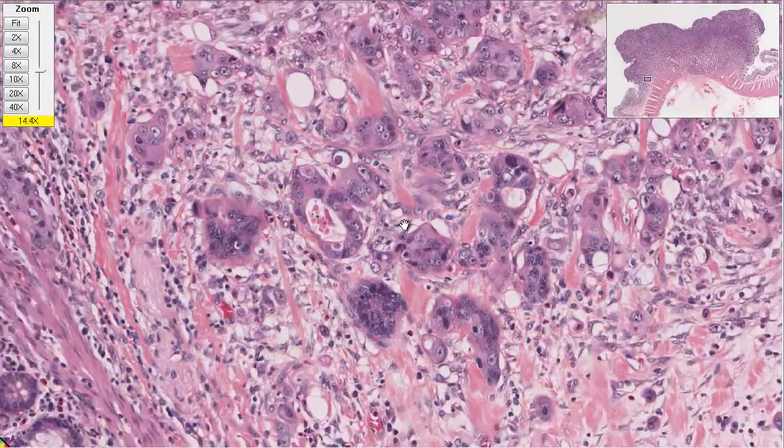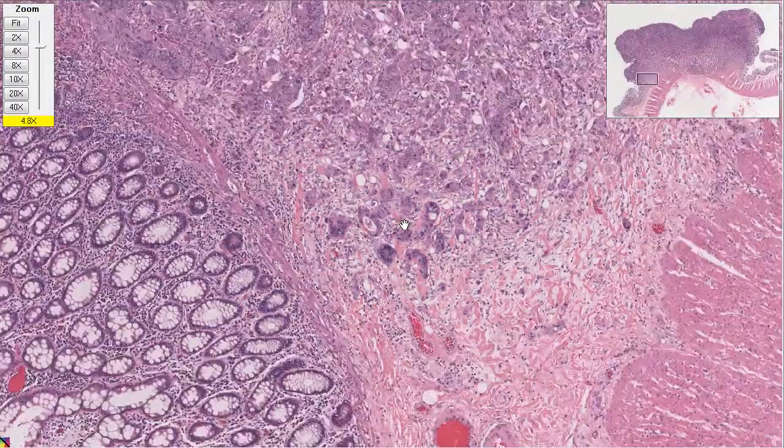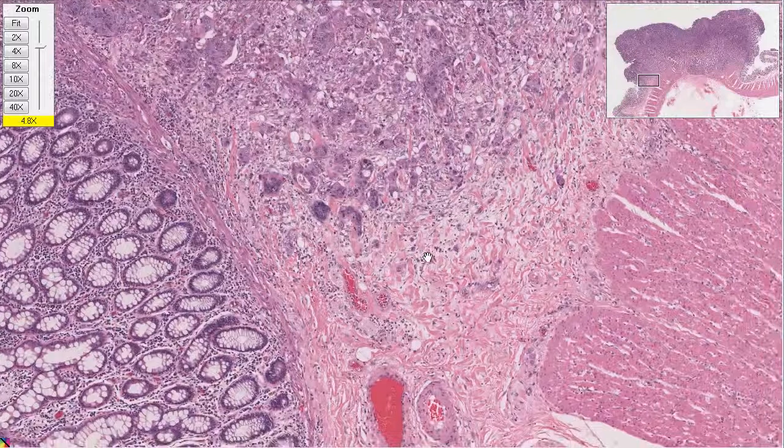So if we found a polyp that had this stuff that didn't cross that boundary line yet, we still would say, no, we've got to take this. Well, I guess we already took it out. You took it out, so that was good. Cancer of the colon is one of the ones where surgical cure is still a classic. Cut it out, and you're probably in pretty good shape.